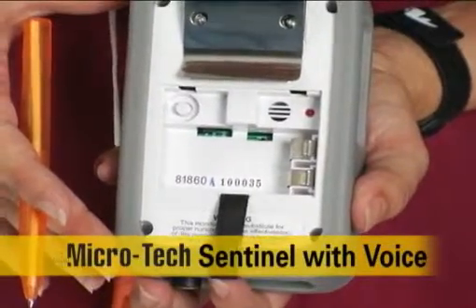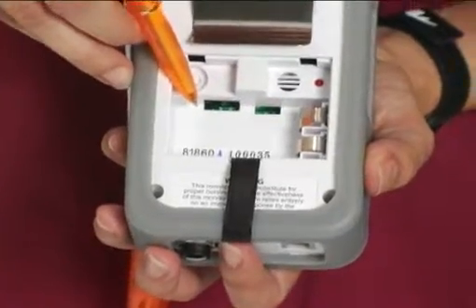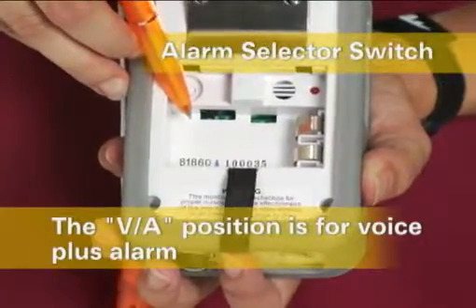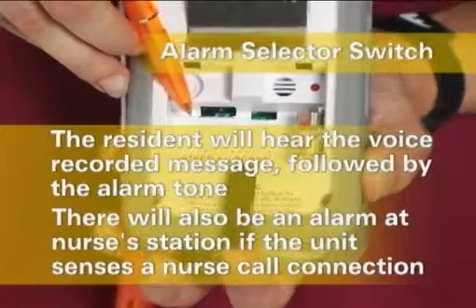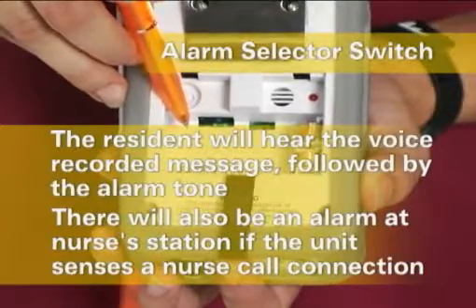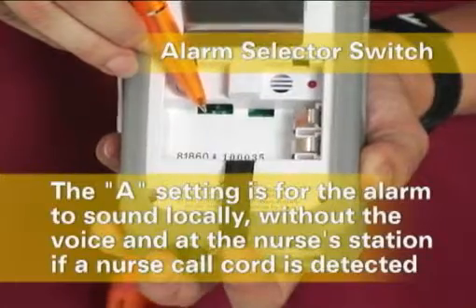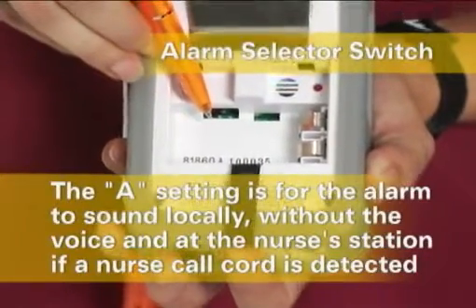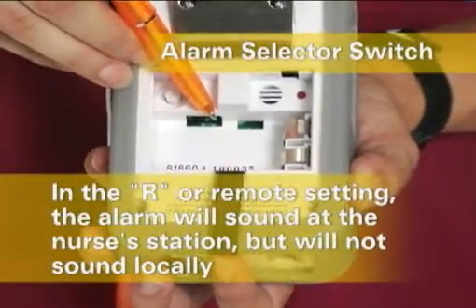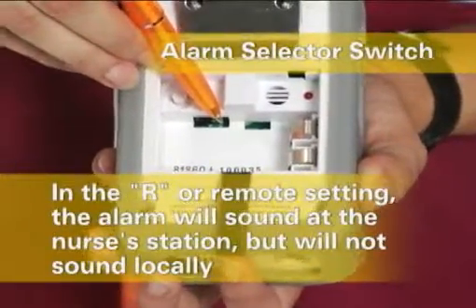On the Microtech Sentinel with Voice, there are additional features. The alarm selector switch has three functions. The left VA position is for voice plus alarm — when an alarm is triggered, the resident will hear the voice recorded message followed by the alarm tone. There will also be an alarm at the nurse's station if the unit senses a nurse call connection. The A setting is for the alarm to sound locally without the voice and at the nurse's station if a nurse call cord is detected. In the R or remote setting, the alarm will sound at the nurse's station if the Sentinel is connected to the nurse call system, but will not sound locally.